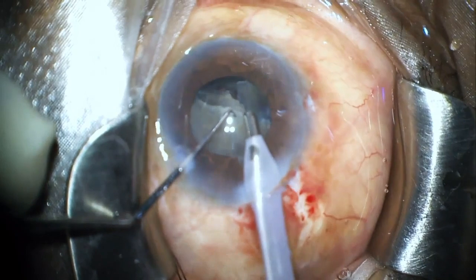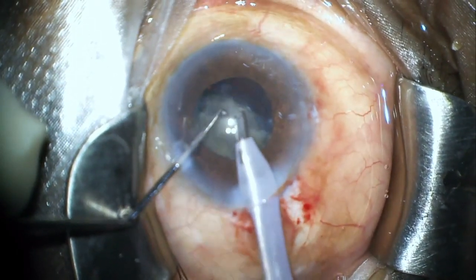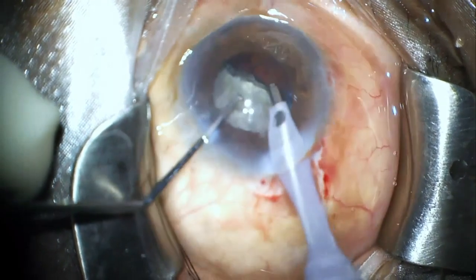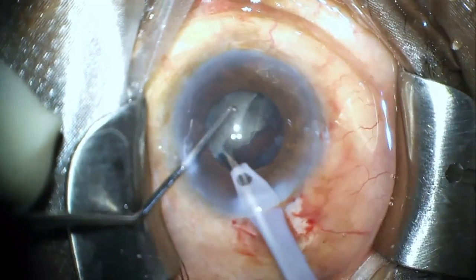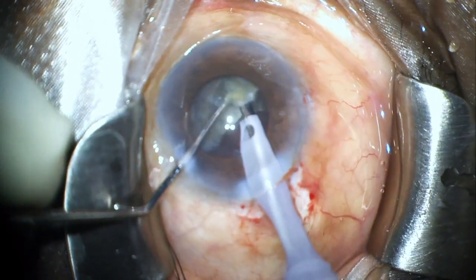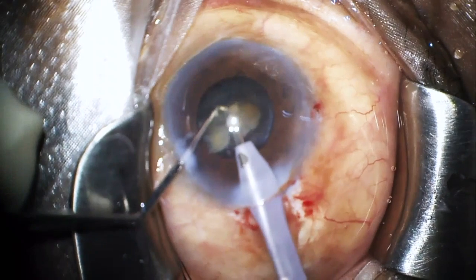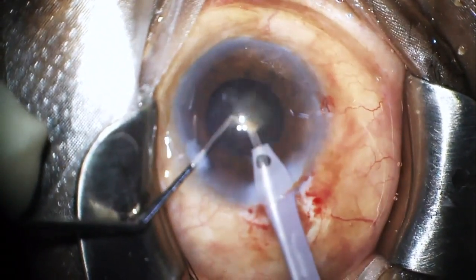Here I am doing the phacoemulsification after dividing the nucleus into multiple fragments and everything seems to be going smoothly. I am feeling happy that the phaco part has gone well and now I just need to do the cortical aspiration and put the lens in the back and I will be done with the case soon.